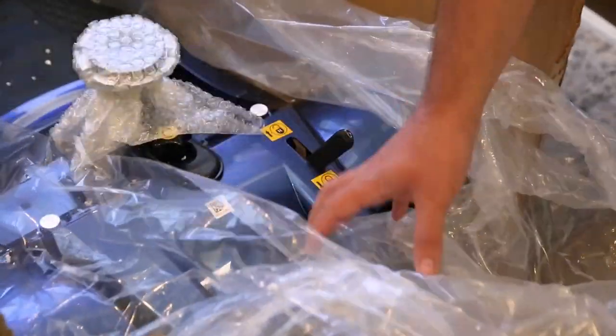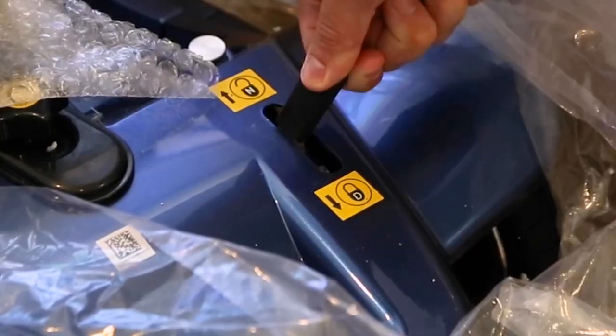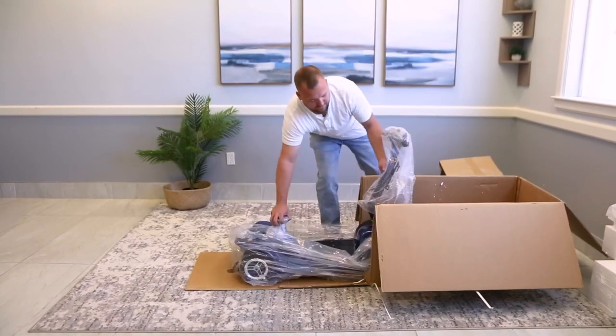Now take a look at this lever. D is for drive and N is for neutral. Make sure the lever is switched to N, which will unlock the brakes and allow you to move the scooter without turning it on. Grab the handle on the back of the scooter and pull it out of the box.